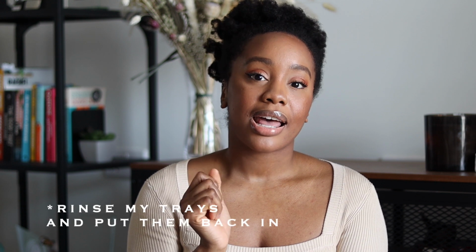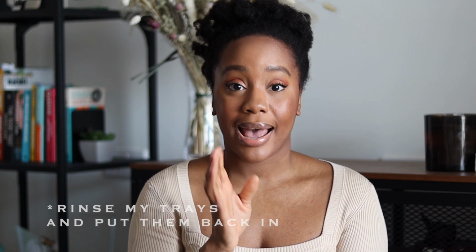Then I will go eat or drink whatever I want, and then when I'm done, I will brush my teeth again. I have an electric toothbrush, so I'll just brush my teeth with that for a minute, and then I will put my trays back in.